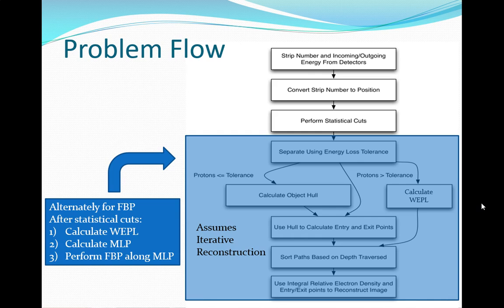So we remove things that were nuclear. Sometimes you'll actually get protons that come out with more energy. Sounds weird, eh? Yeah, that's because it didn't come out with more energy. You got a proton with more energy coming out. It could be right in line and you still hit a nucleus, and it just happened to fire one lined up, and the nuclear event propelled one of its own protons, called a secondary proton, really fast at your detector. There's a chance it could be well enough lined up that you count it. So we also have to watch for that little bit too high of an energy.